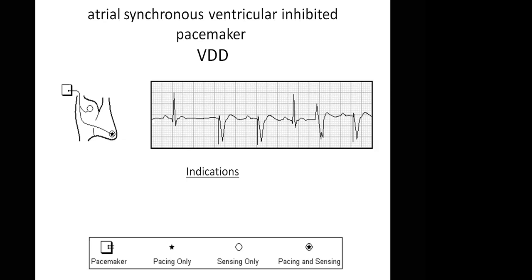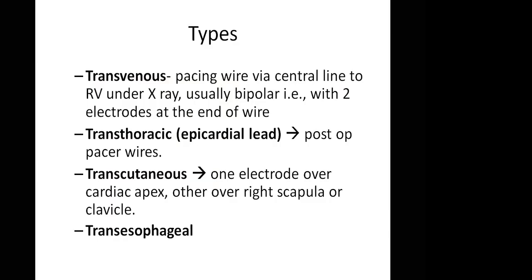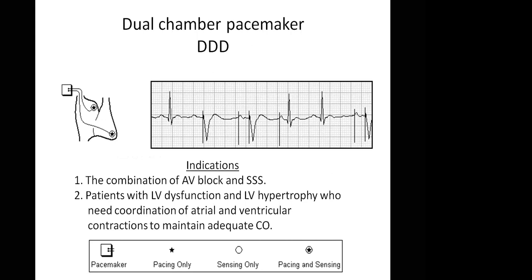So what I'll do is that when I get to the programmer machine, I will snap the full programming code for Medtronic. It's on the machine. You will see all the combinations for exam purpose. I think we've talked about temporary pacemaker. We are done with all the coding, the extension of the coding, clear cut.